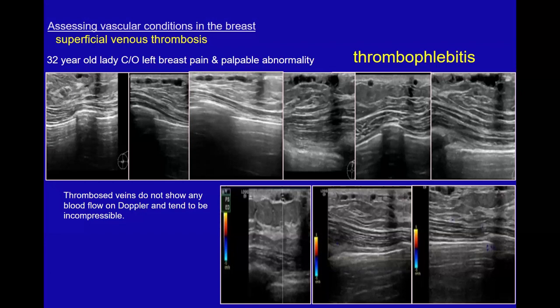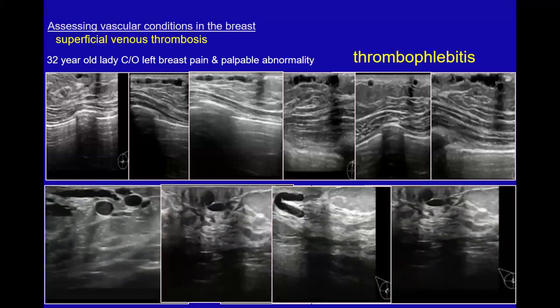It can be associated with breast cancer, but sometimes can even be related to trivial trauma, like something hitting the breast, or even her child hitting her breast while lactating. Okay, and we have to be cautious and differentiate it from ducts.